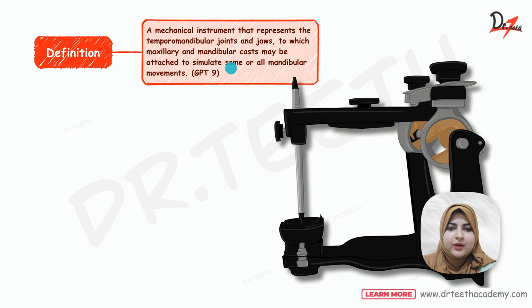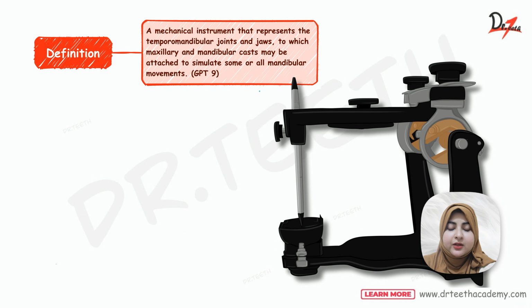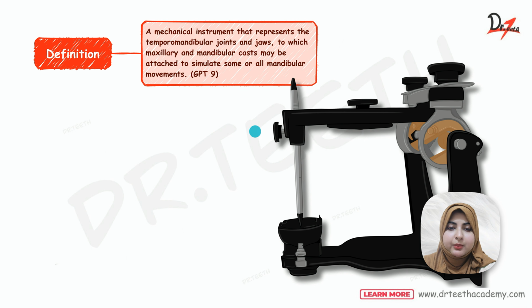Okay. So according to GPT-9, you should know this definition if you are still a student, that it is a mechanical instrument that represents the temporomandibular joints and jaws to which maxillary and mandibular casts may be attached to simulate some or all mandibular movement.